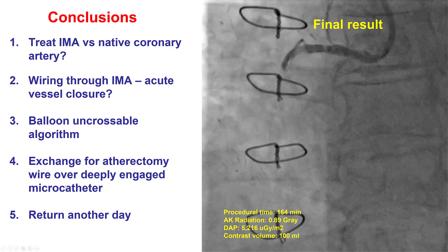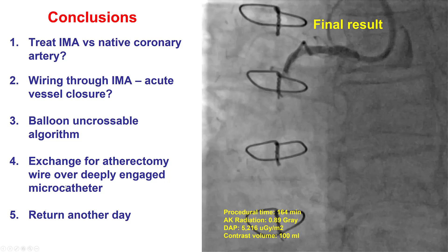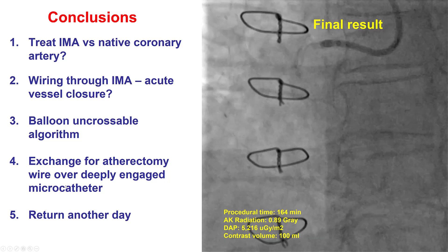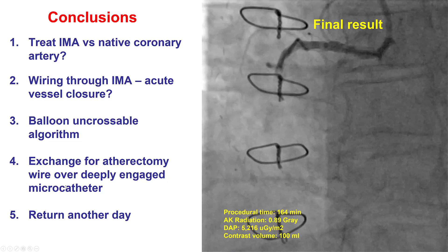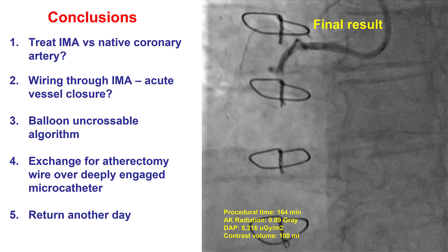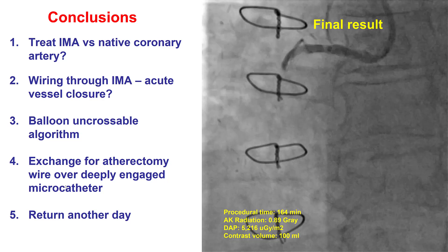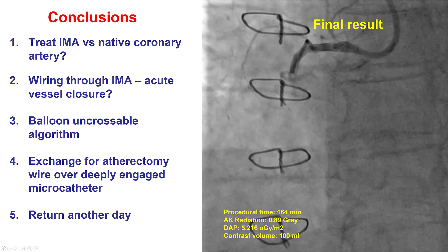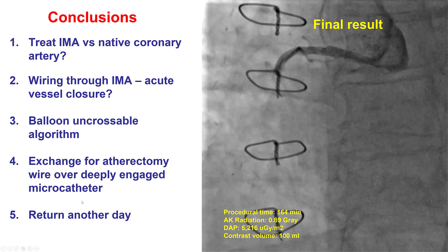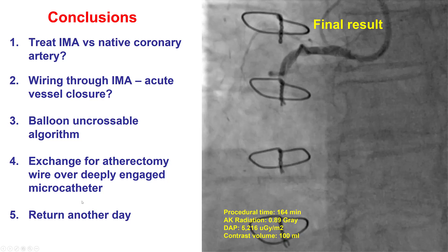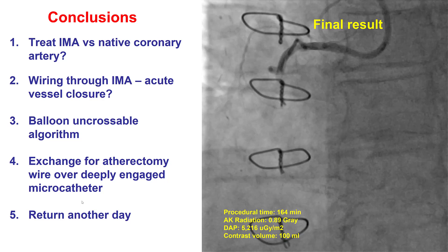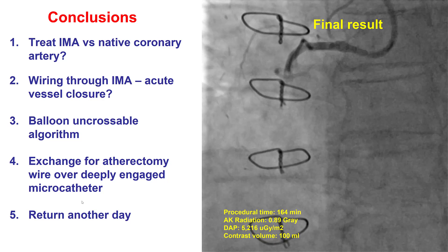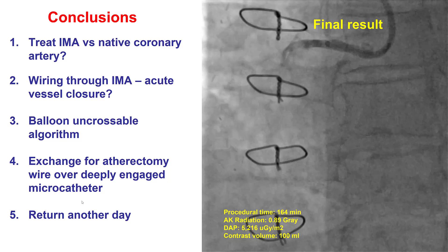Fourth, we illustrate how a deeply engaged microcatheter into the uncrossable lesion can be used to successfully exchange the 0.014-inch guidewire for the atherectomy wire. And finally, this is another example where when things don't seem to work, especially if the patient is stable, it may be best to stop and come back another day for a repeat attempt.